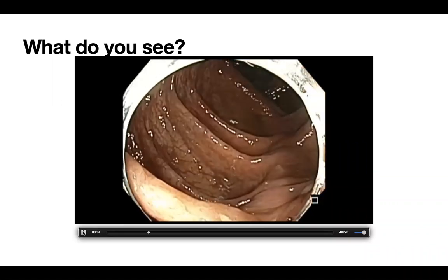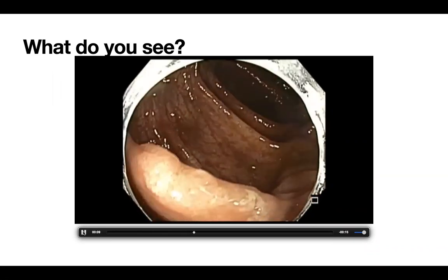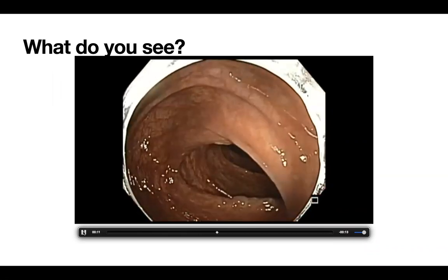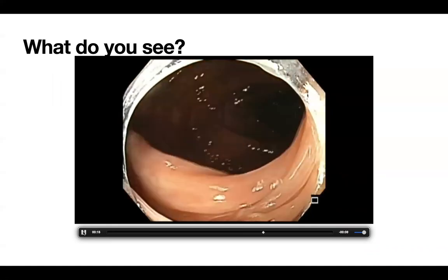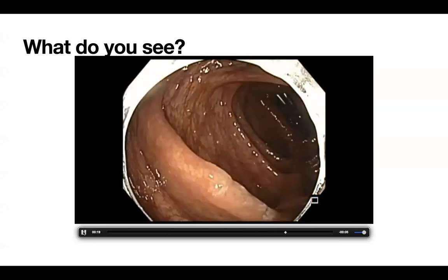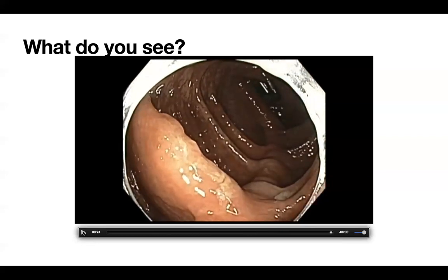Sriram? What was the question, sir? I missed that part. Are you just talking about comment on maintaining? Yeah, maintaining and then comment on the polyp. Yeah, I was just trying to type a few comments on the suboptimal prep. Just one more question. Is this the regular session, or are we waiting for pathologists to comment, make a presentation or something so that I can appropriately talk about it? No, the pathologist has slides, images once we do the resection of the polyp, and then they all will comment on that. Okay. Yeah, two, three other comments.